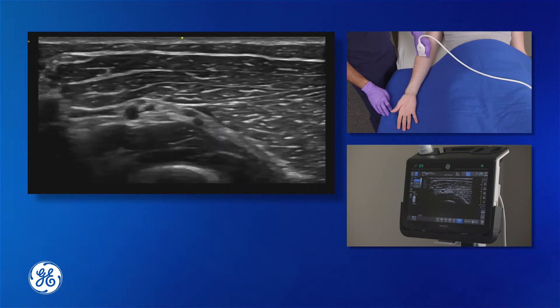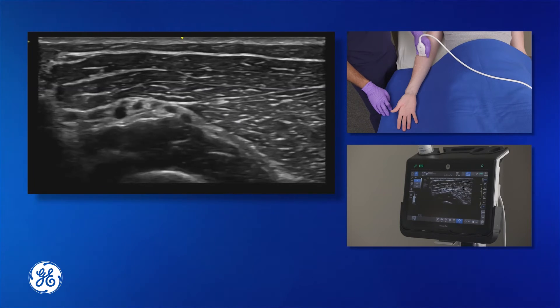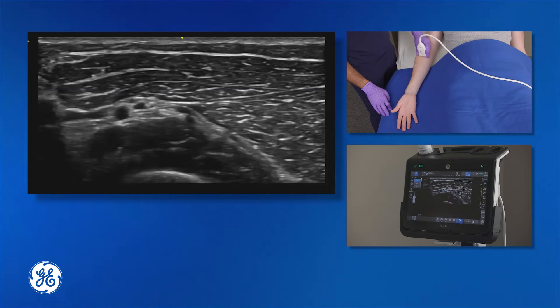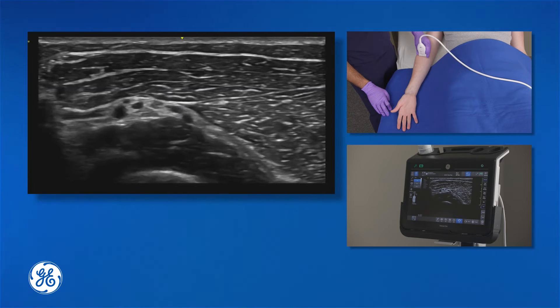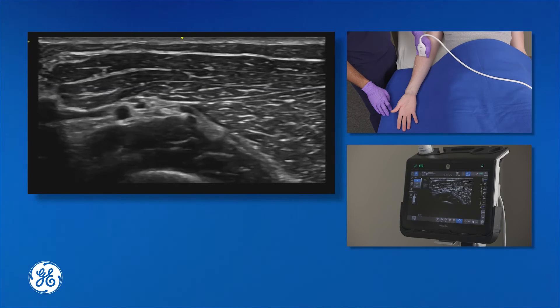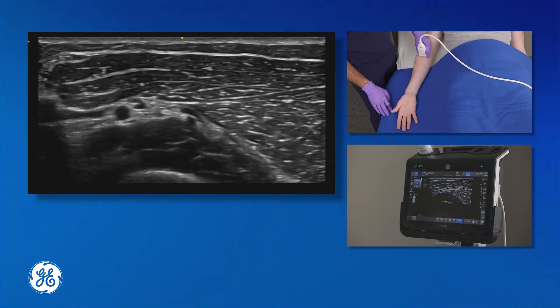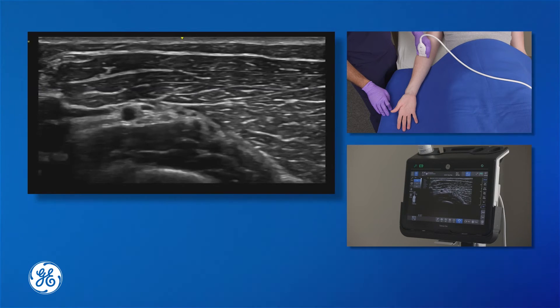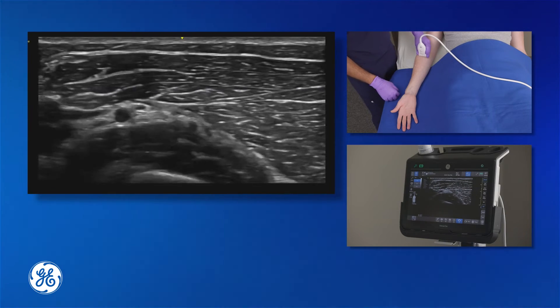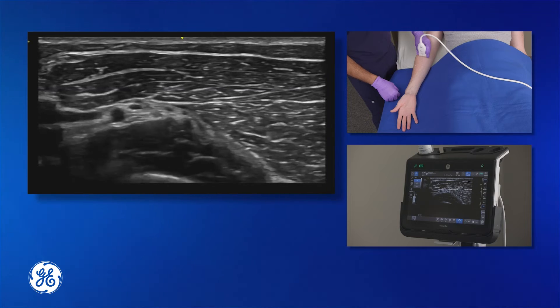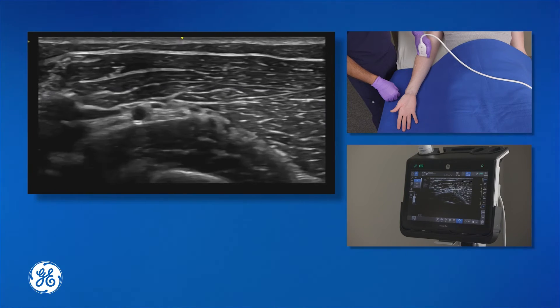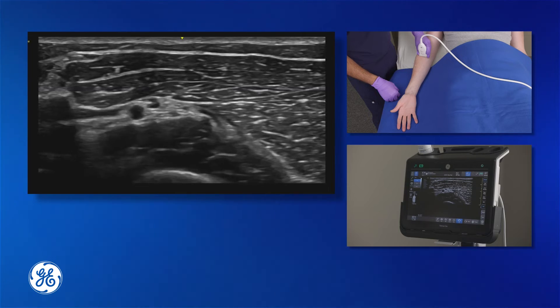This is the area that I would like to use to perform the block. What I like to do now is use a sterile marking pen and mark the region so that I know where to place the ultrasound when I start the procedure. After doing that and then reestablishing view on the nerve, you have to get the equipment that you're going to use.